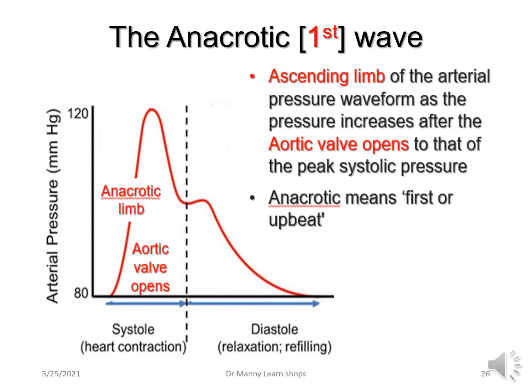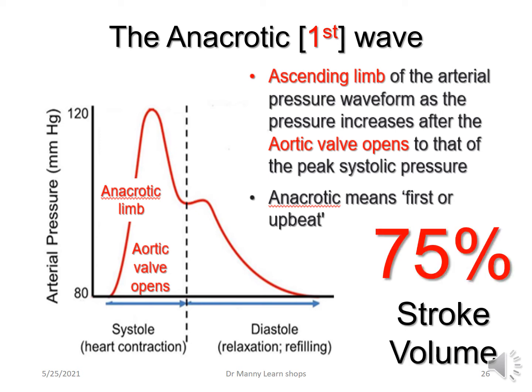Now the anacrotic basically means it's the first part of the blood pressure waveform. And in the Greek or in the Latin, it basically means first or the upbeat. And during this phase, you get 75% of stroke volume being ejected from the heart into the systemic circulation.